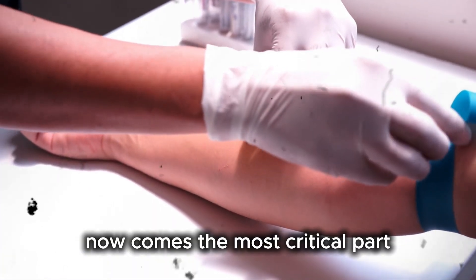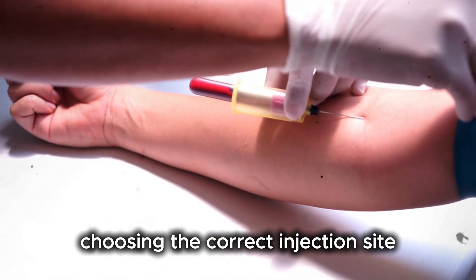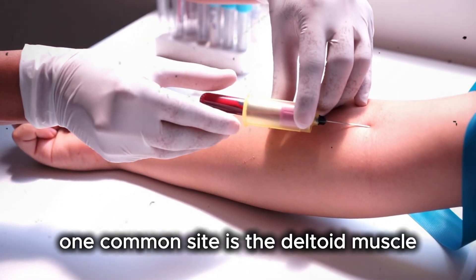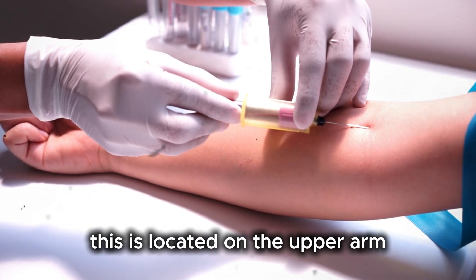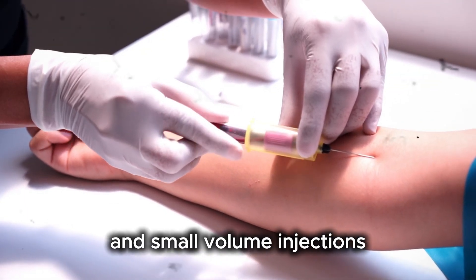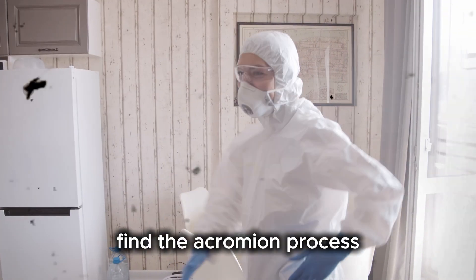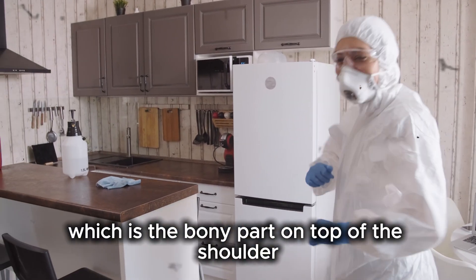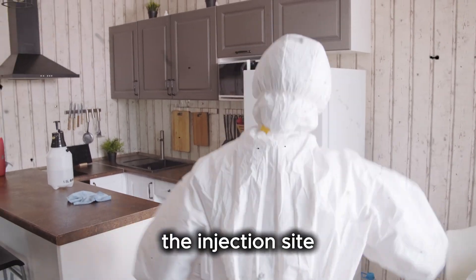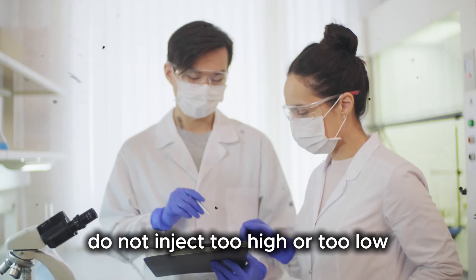Now comes the most critical part, which is site selection. Choosing the correct injection site prevents nerve injury, pain, and poor absorption. One common site is the deltoid muscle, located on the upper arm, commonly used for vaccines and small volume injections. To locate it, ask the patient to relax the arm. Find the acromion process, which is the bony part on top of the shoulder. Measure about two to three finger widths below it. The injection site is in the thickest part of the muscle. Do not inject too high or too low.